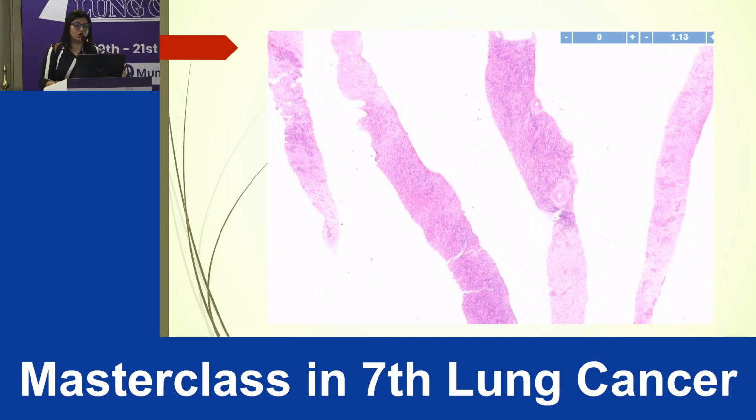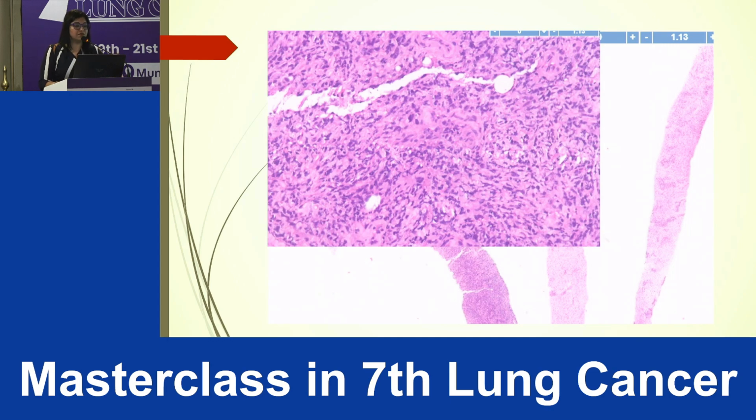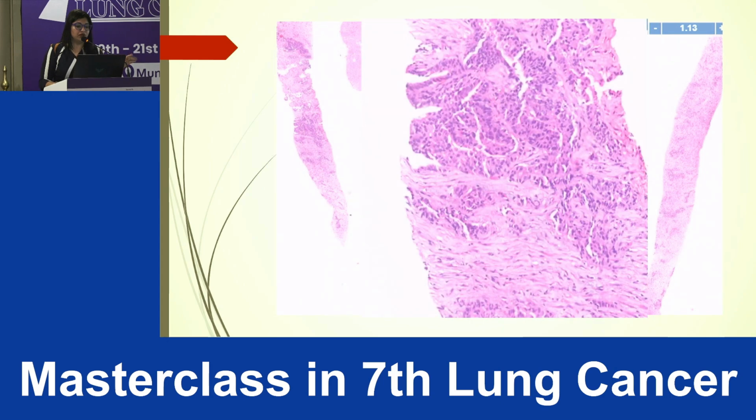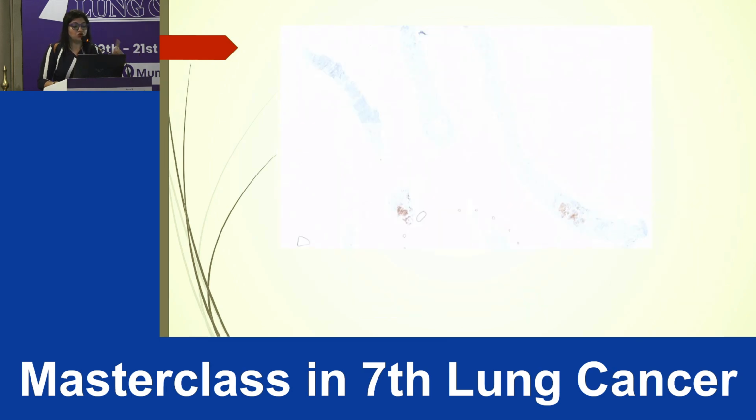So meanwhile, we got a repeat biopsy. This was the same patient, pleural biopsy. It was an entirely sarcomatoid tumor, but just one core showed a papillary pattern, just 1 to 2% of the core, and this was given as a metastatic thyroid. The point here is that the histology was very varied, and it was looking very high grade. Again here it was PAX8 and TTF1 positive, and just for academic purposes, NGS was repeated here. We saw the same fusion partner here with a very high read count.